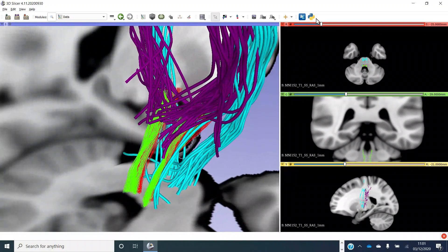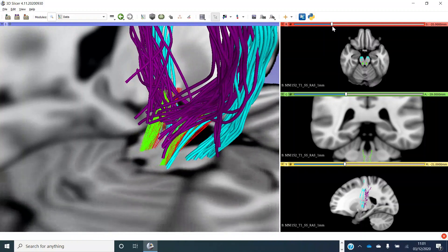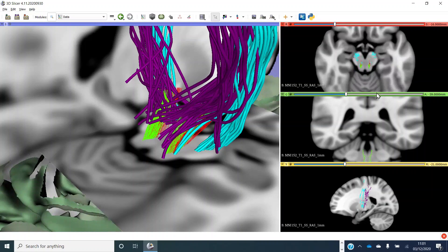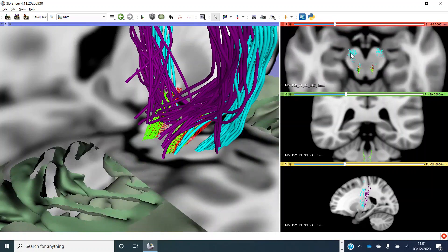Going up to the level of the midbrain, we can see very nicely our motor fibres running within the cerebral peduncles, and we can see our sensory pathways running in the more dorsal portions of the midbrain.